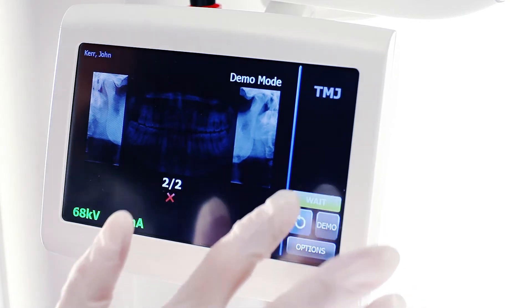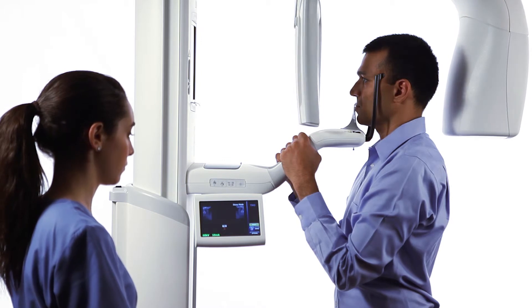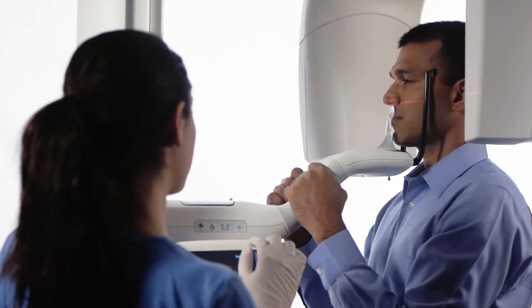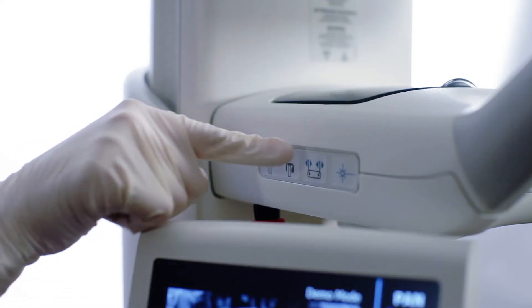While the patient remains in place, return the overhead structure to the patient entry position. Once this movement is complete, realign the patient's Frankfurt plane and midsagittal line and close the temple support wands.